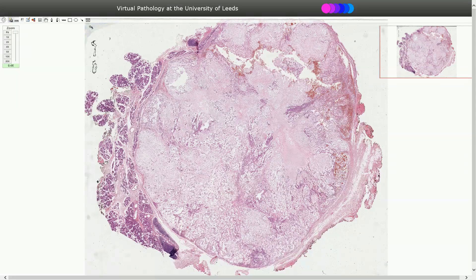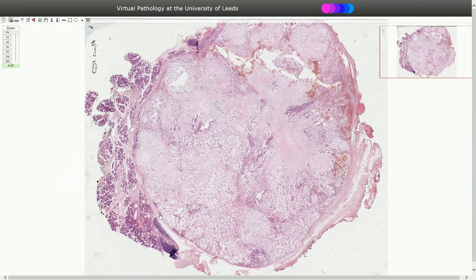Pleomorphic Adenoma is a benign epithelial tumor of the salivary glands that shows epithelial, myoepithelial and mesenchymal differentiation. It is most common in the parotid gland and it is slow-growing, benign and usually well-circumscribed. It is outlined by a fibrous capsule, as we can see here, and in the periphery we can see the remnants of the salivary gland.